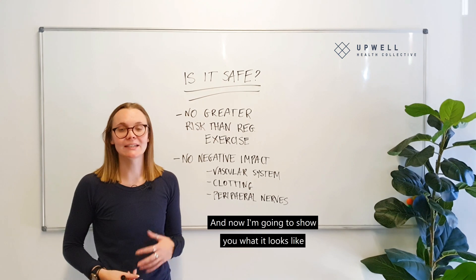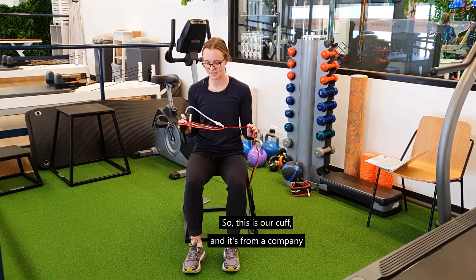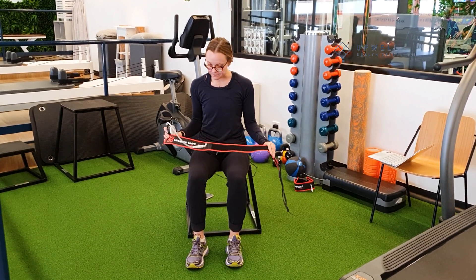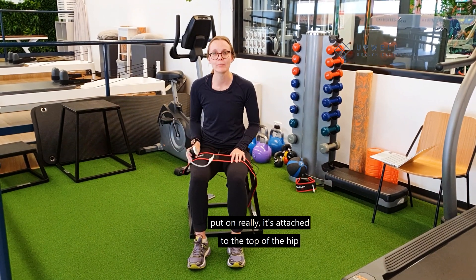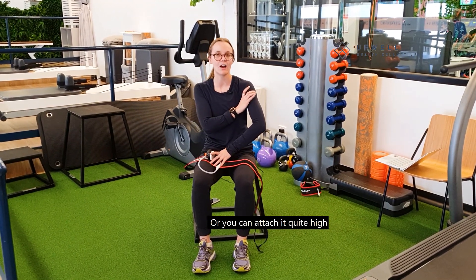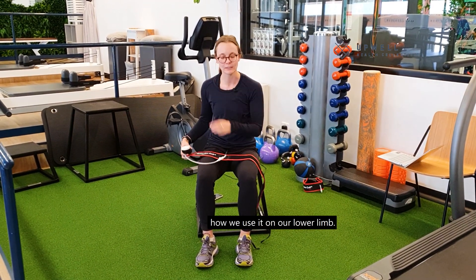Now I'm going to show you what it looks like to have the occlusion cuff on and how we use it in training. This is our cuff — it's from a company called the Occlusion Cuff and this is the elite version. You can use it on a few different body parts. Predominantly it's attached at the top of the hip for your quads, hamstrings, and lower body, or quite high up for your biceps, triceps, or upper limb. Today I'm going to show you how we use it on the lower limb.